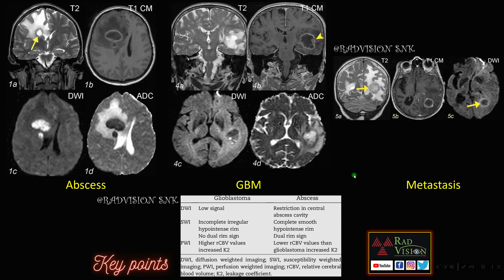Next case: diffusion weighted imaging also helps in differentiating abscess from necrotic or cystic tumors like GBM and even cystic metastasis. Whenever you have a cystic lesion in the brain with some perilesional edema and you are confused, try to use diffusion weighted imaging as one of the sequences to differentiate them. Here you can see this is the abscess where you can see restricted diffusion on DWI in the core with low ADC values.